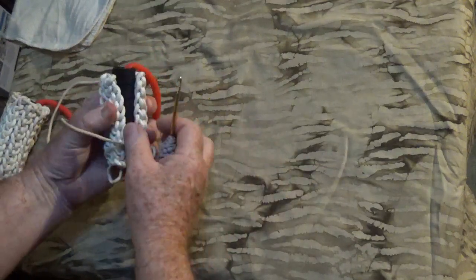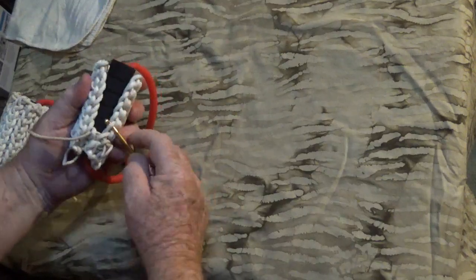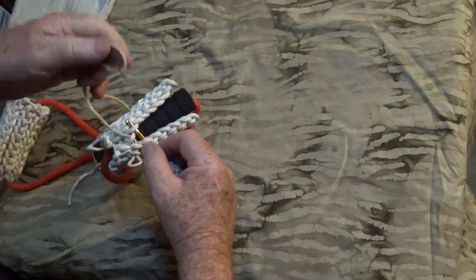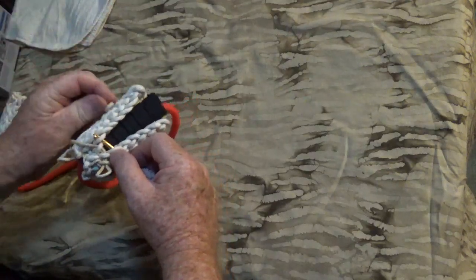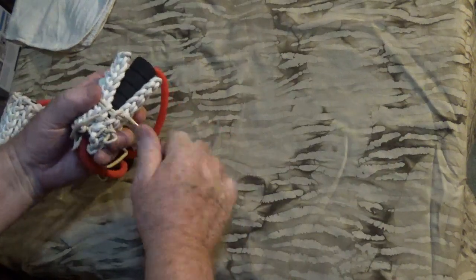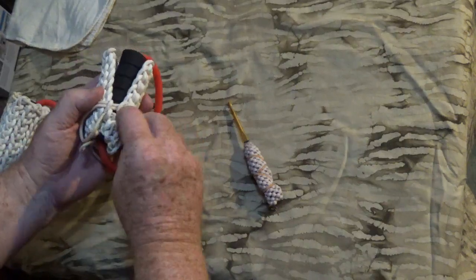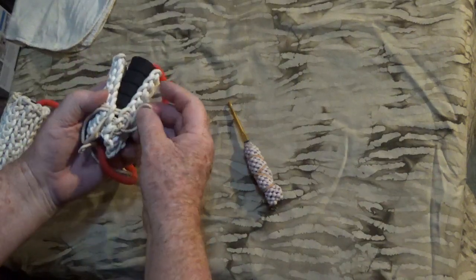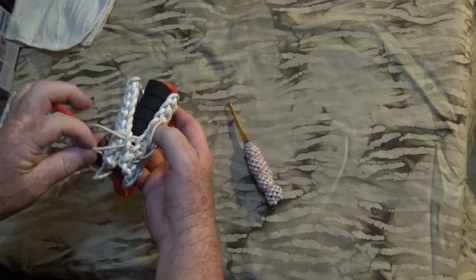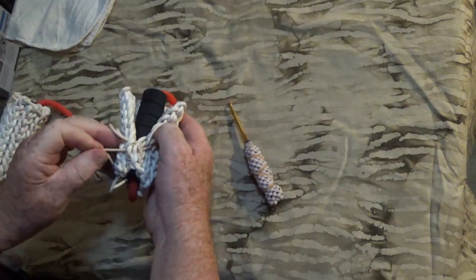Once again, find the next 2 humps; we're going to go through those loops. Standing end comes up, that makes it easier. Hook it on the crochet needle, bring it through the 2, then that comes up and through the previous loop. Hold the new loop with your thumb, and we're going to pull the bottom to tighten up the previous loop, grip around the new one.